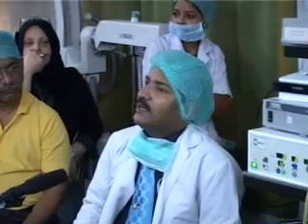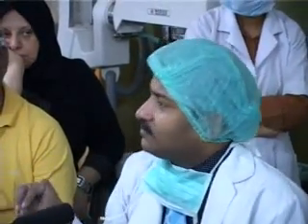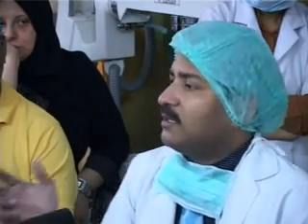I don't know why many gynecologists, when they burn the fallopian tube, immediately irrigate it. Why? Because they want to make it cool, so that it will not harm the other tissue, but it is not required. Generally, I have not seen it much in any of the big hospitals, but I have heard that some people do that. It is not required at all.